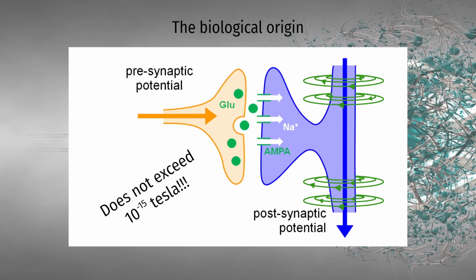Now I would like to tell you more about the main principles of the biological system that the device measures. The chemical reactions in the neurons produce an electrical current. This current goes from the presynaptic neurons to the postsynaptic neurons. And when enough current passes through the neurons, it generates a magnetic field. And since these magnetic fields are very small, we use flux transformers.